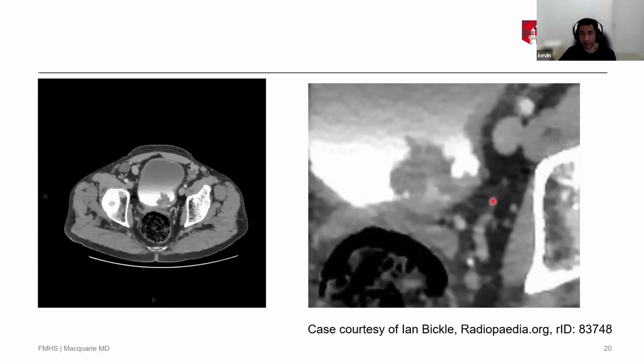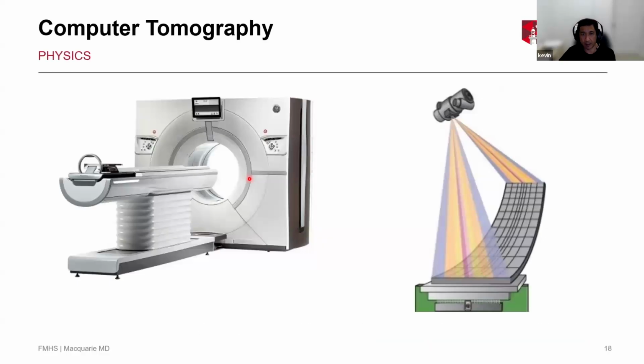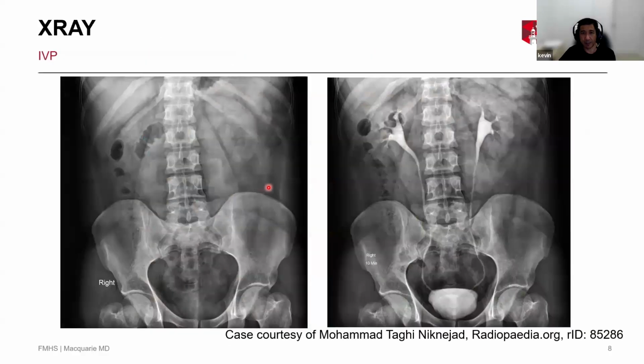Now, when I started the discussion, I said we're going to image the whole urinary tract. The kidney actually produces the urine, so that's in fact going to be the first place where you're going to see opacification, and you get this sort of image. So remember our first image? In fact, what I might do is go back to remind you. So I'm going to skip all the way back. Sorry. Oh, there we go. That's the image.